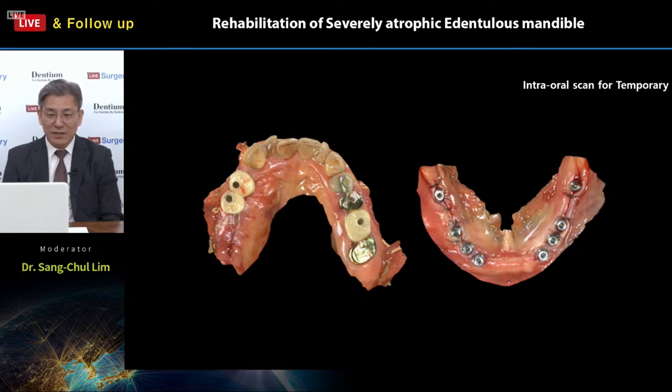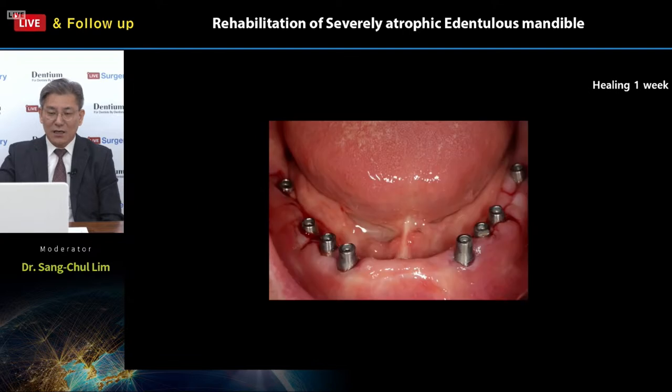As you can see, numbers 14 and 15 on the maxilla and number 24 area, simultaneously, PMMA temporization was already done. And for the lower, actually, the same day intraoral view. And at 1 week of healing, very nice, good, faster soft tissue healing was shown, right?